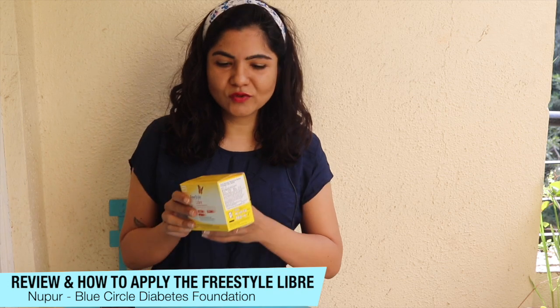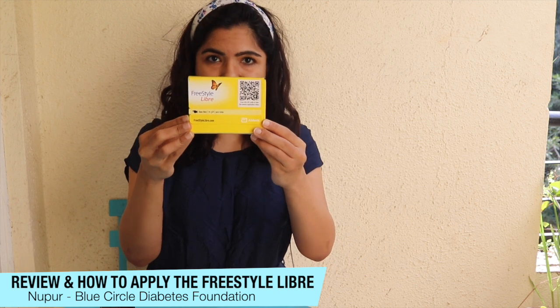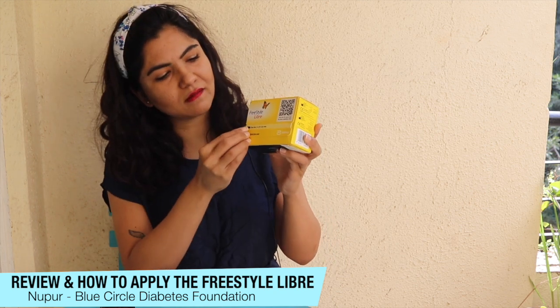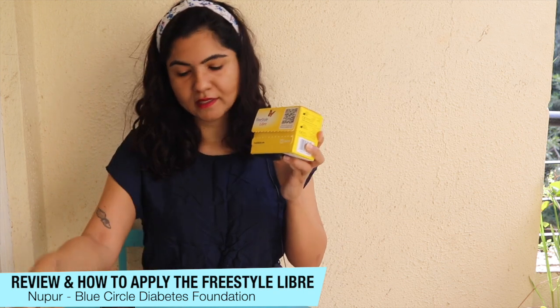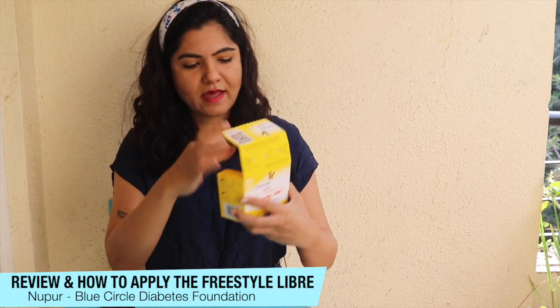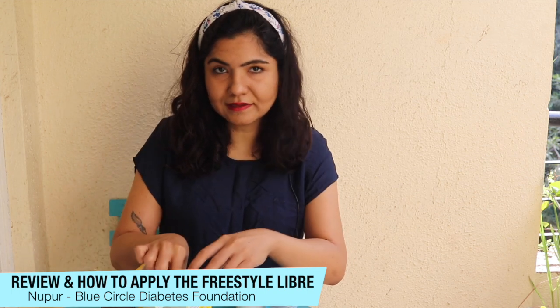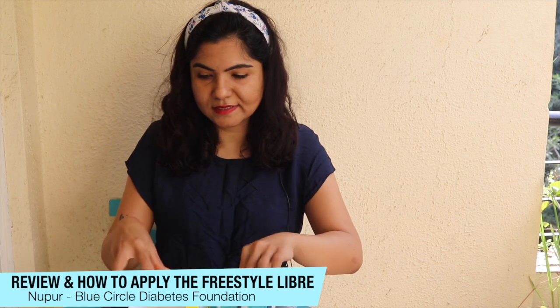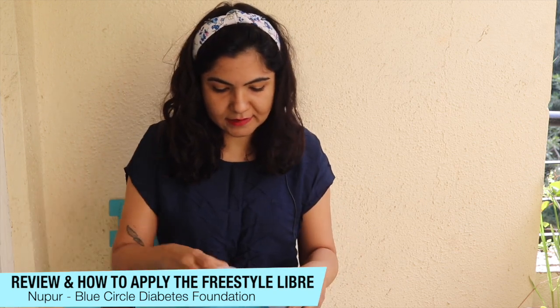Alright, so now we're going to apply a Libre Sensor that comes in this package. You can see that it's sealed, so I'm going to open the seal. Now the seal is open and I'm going to quickly open it up and show you what's inside. There are three parts to the sensor pack.